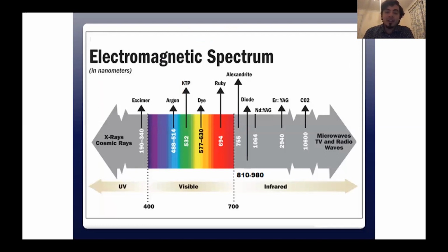So, if we remind ourselves of a summary of the electromagnetic spectrum, going back to our physics days, we're looking at the area in the electromagnetic spectrum which is in the infrared zone. So our composite curing light is in the visible light spectrum, whereas if we go into the infrared spectrum, that's where we are going to be talking about soft tissue lasers in dentistry, and especially diode lasers that we're concentrating on specifically.